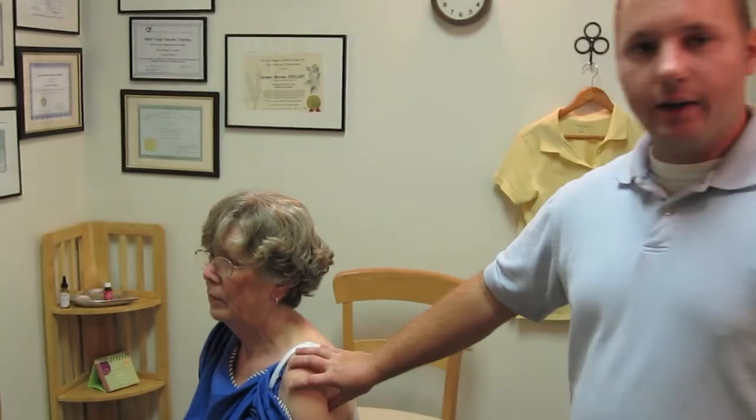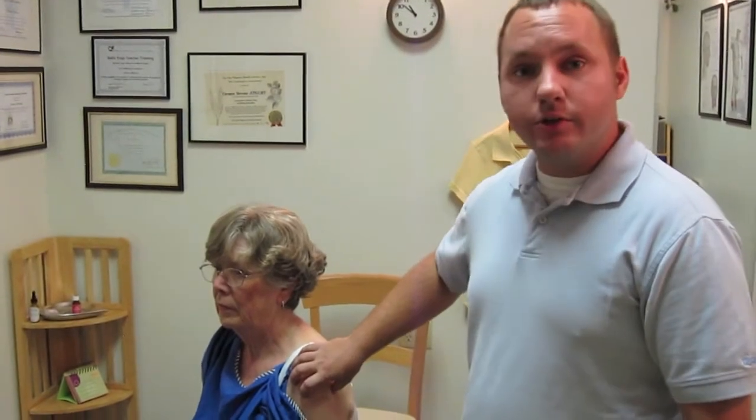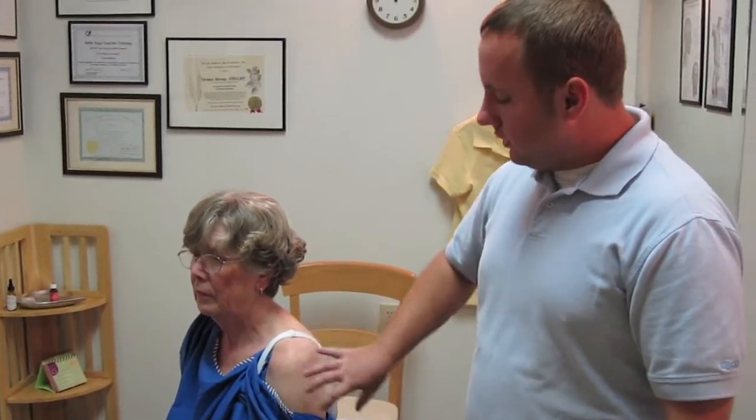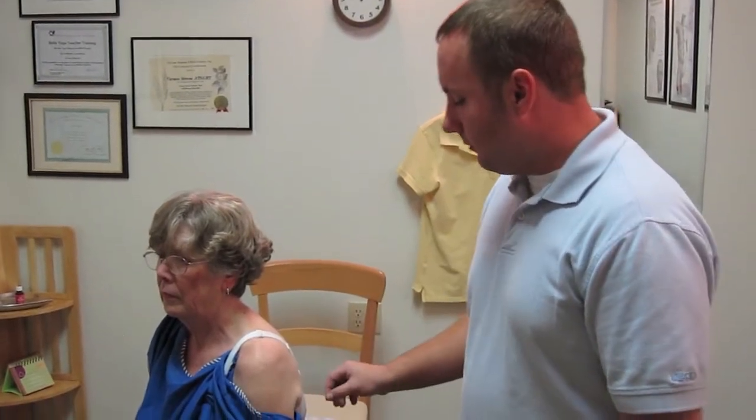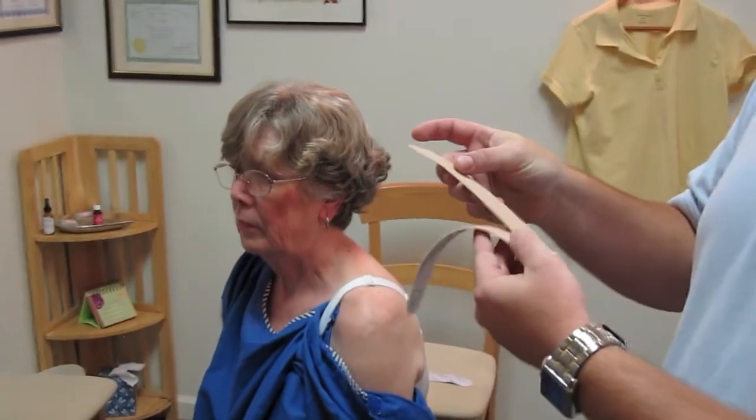So this is Dr. Stice. Hello. Today our patient here has a shoulder injury. What we're going to do is help with stabilizing the shoulder joint itself. There are two different kinds of taping styles for shoulders. You can do it for muscle relaxation or muscle facilitation, which is contraction. The first thing I'm going to do — I already have a piece of tape cut — it's called the Y-Cut.